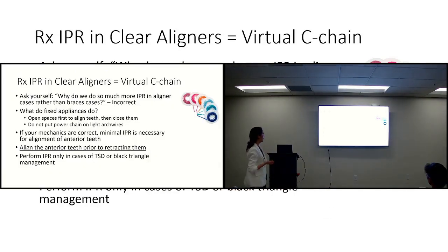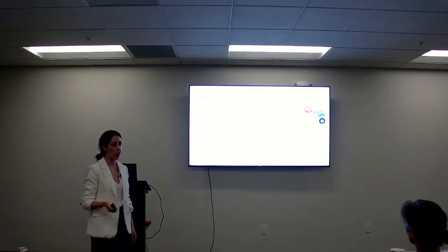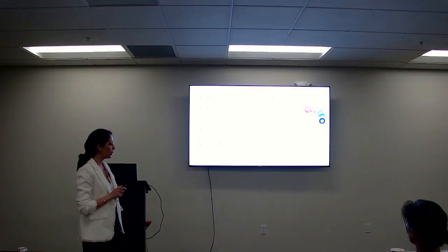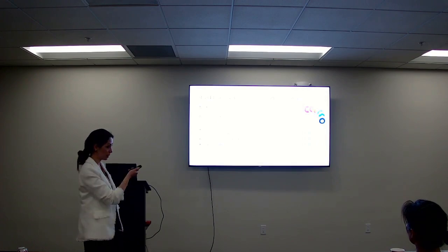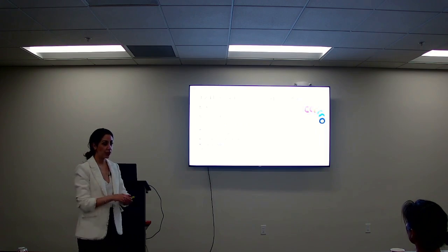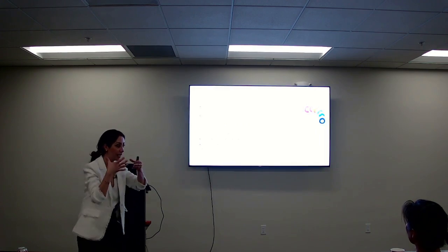So let's talk about IPR. When you prescribe IPR, what are you actually doing? Think about the plastic. What is the plastic doing? You're putting a power chain on the teeth. You all know what a power chain is, which we use with braces all the time. You're taking the arch and you're squishing it.